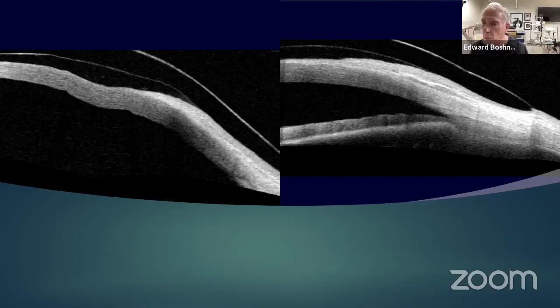So I take the images with the aberrometer. That is uploaded to a laboratory associated with the University of Rochester. They do something with that information, send it to the lab in iPrint, for example, and they take that information and embed it into the optics of a lens. That's what I do. There's nothing else. No other technologies other than that I work with.